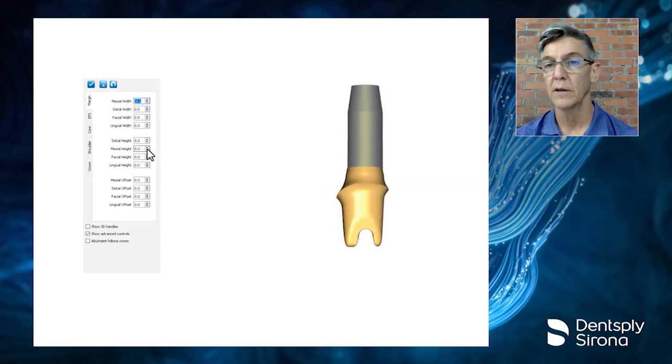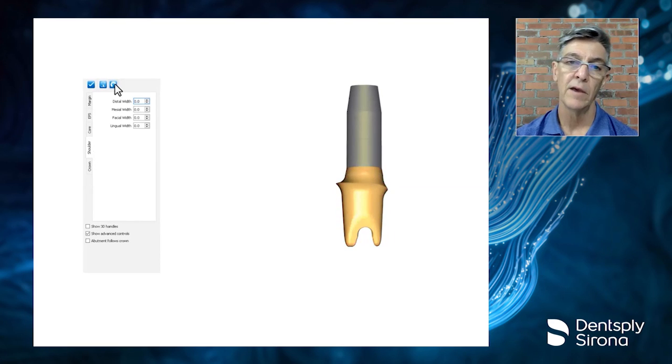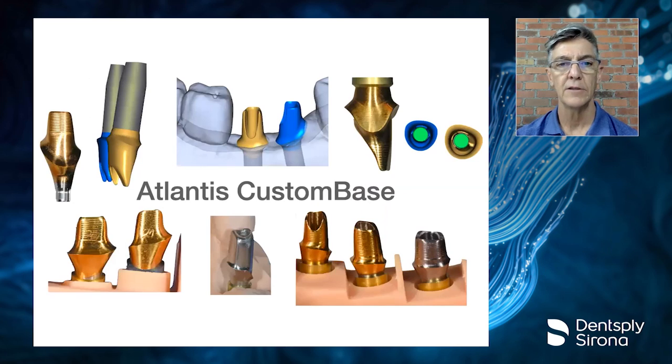Make it larger, make it smaller, make it shorter, make it wider, move the margin, apply pressure to tissue. And should they happen to go a little too far in a direction that cannot be manufactured, the image will turn red. And that simply requires that they back off on what they just did. And then once they're happy with it, good. Click it. It's good to go.